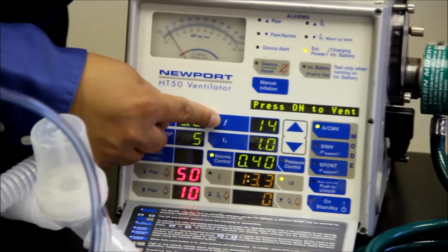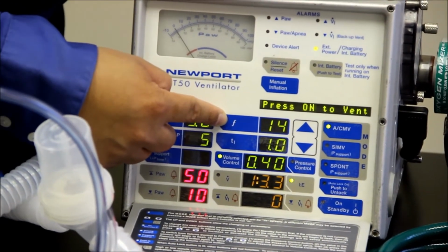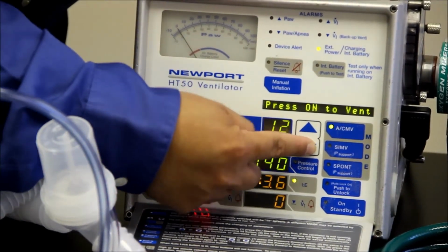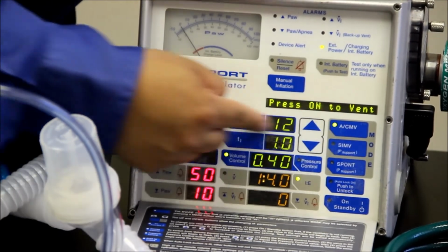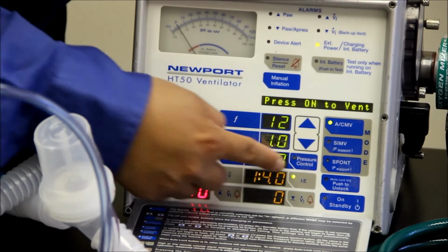And let's go, F is a frequency, or we call it respiratory rate, but it's a frequency, how much we're giving the patient. So I'm just going to change that to 12. So when I press down, I'll just go ahead and change it to 12. So right now we're on AC of 12. I want a tidal volume of 400, so I go down to this button right here.